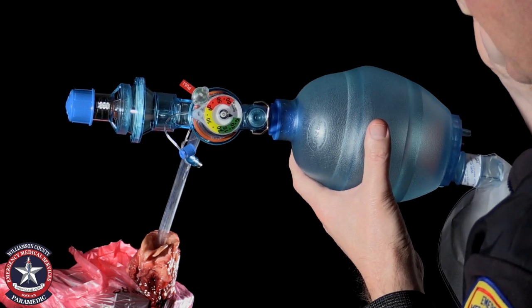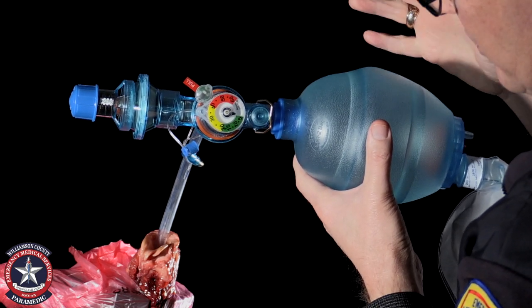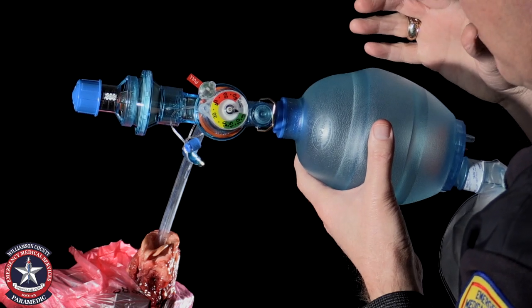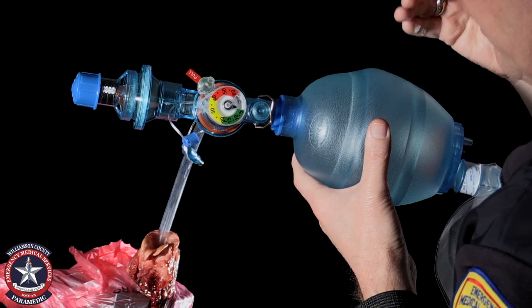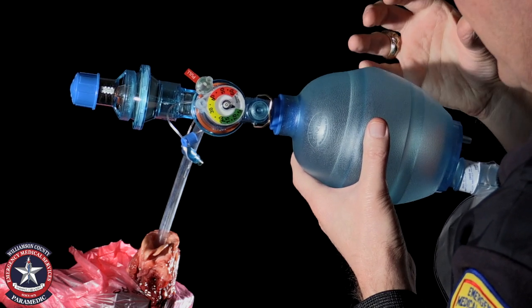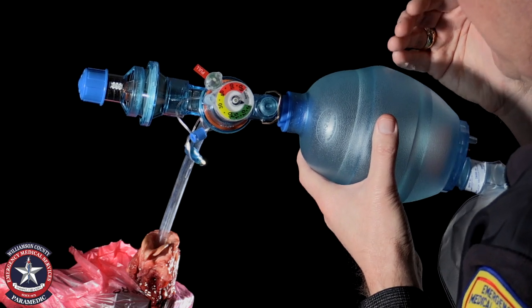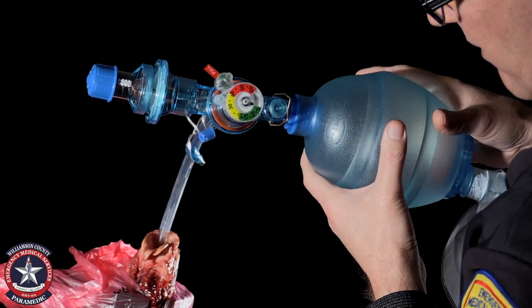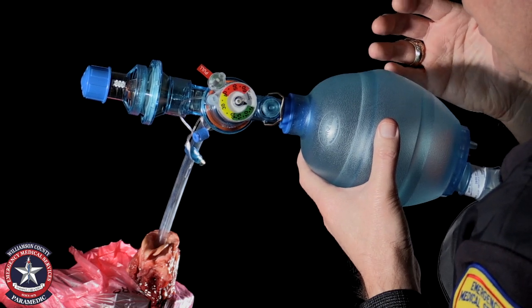Watch the collapse. I'm now going to engage five of PEEP. Notice that the first bag is about the same, but the lung doesn't completely collapse, and then subsequent ventilations expand the lung a little bit more.